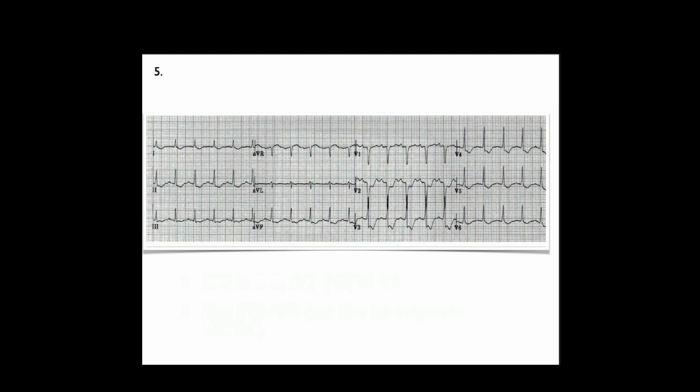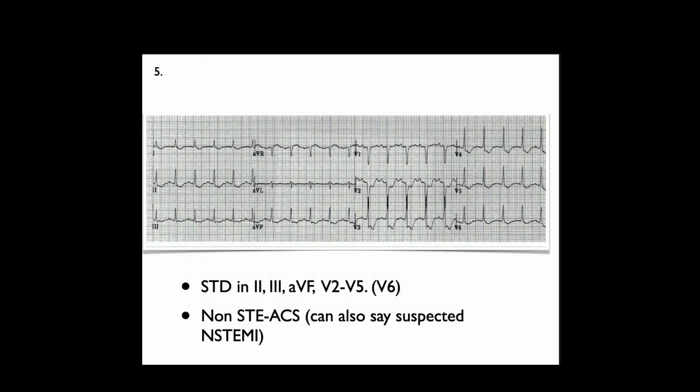Arterial occlusion potentially. And I'm sorry, I missed what you said in the limb leads. What do you see there? Lead 2, depression, AVF depression, maybe a little depression in 3. Okay, especially as they're grouped together. I don't really see elevation. Okay, so I said suspected NSTEMI.